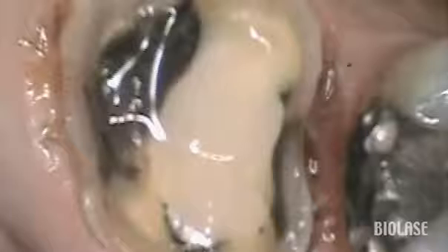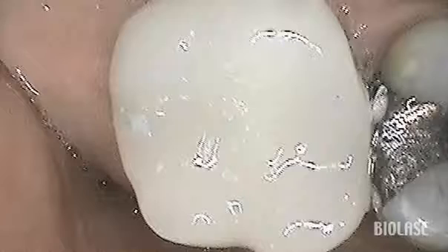These 3 postoperative intraoral photos show the tooth after closed flap crown lengthening, an image after the final preparation and troughing, and the final crown after cementation.